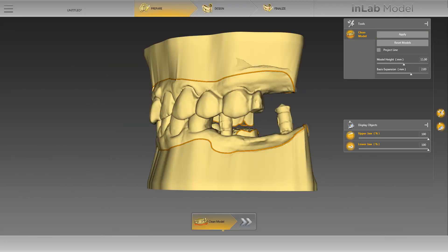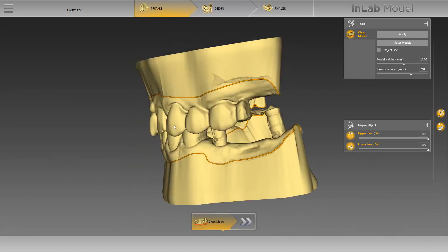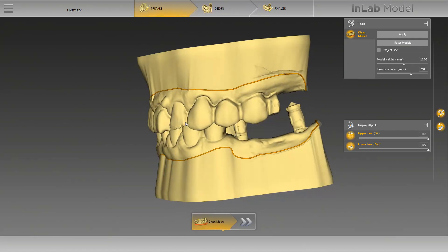After creating the model, you can still change the height or width of the model. We won't continue editing the model and will now check the model from different angles. At this point, we end the phase Prepare and move to the next phase, the Design phase, by clicking on the double arrow.